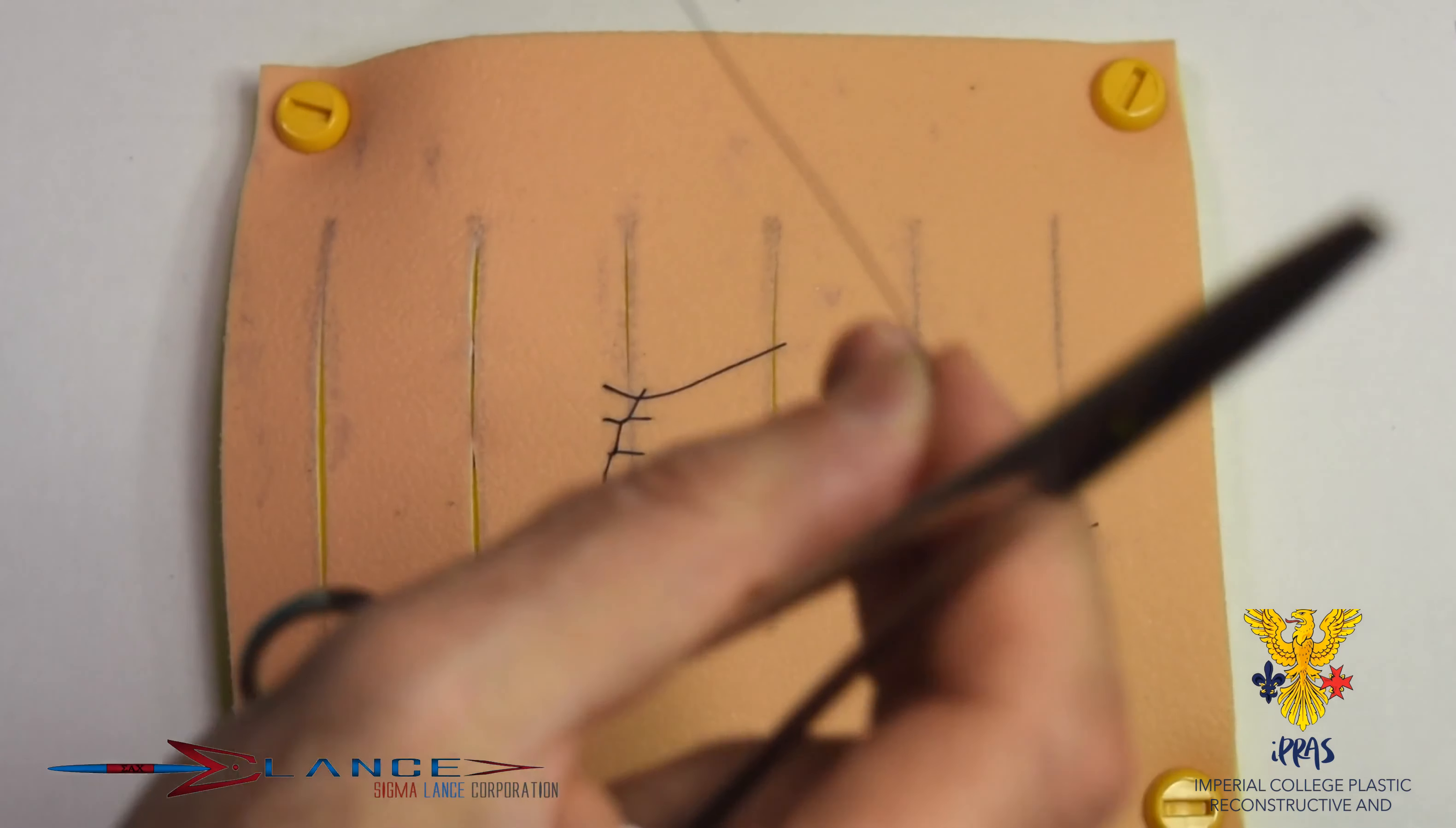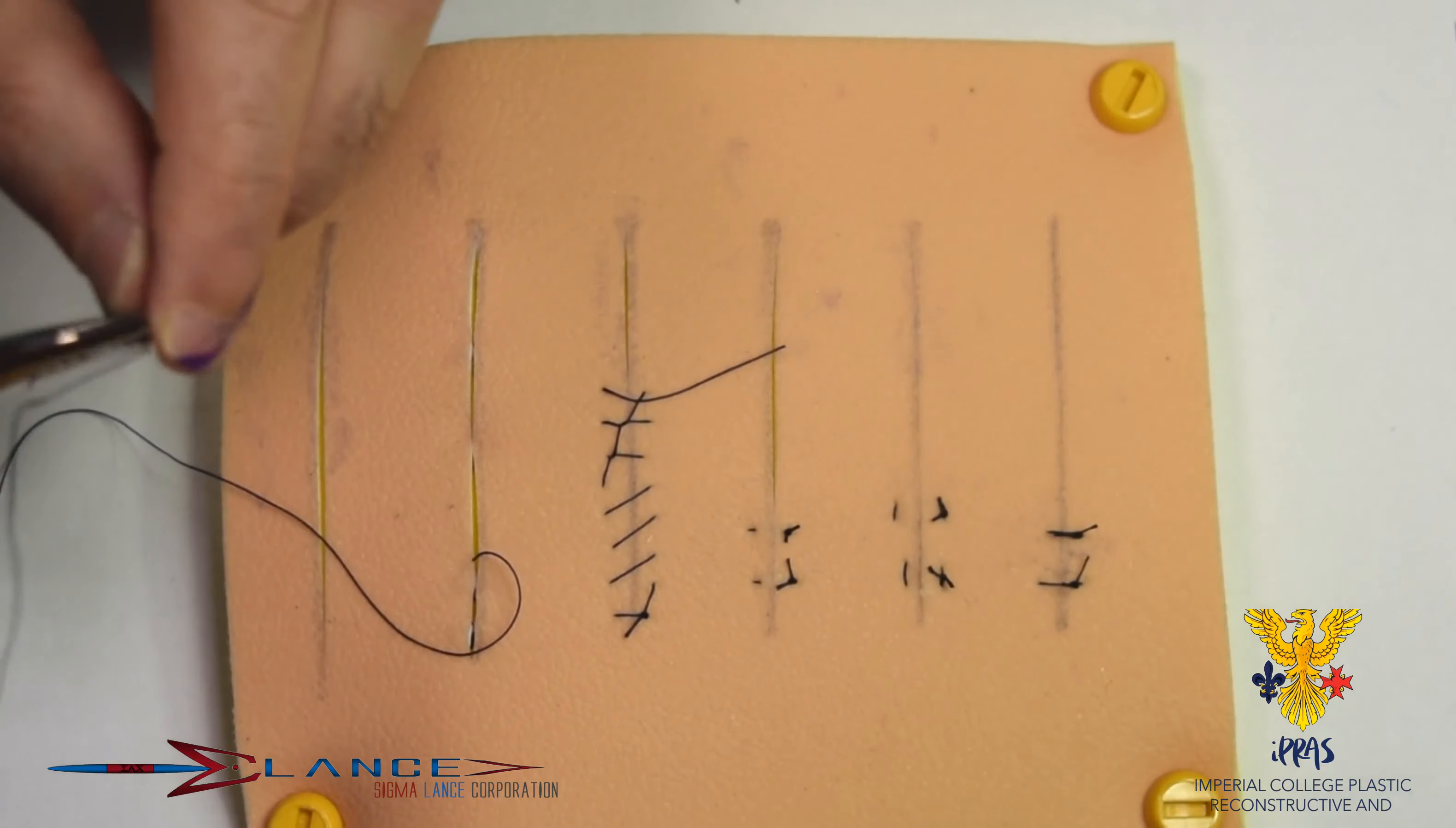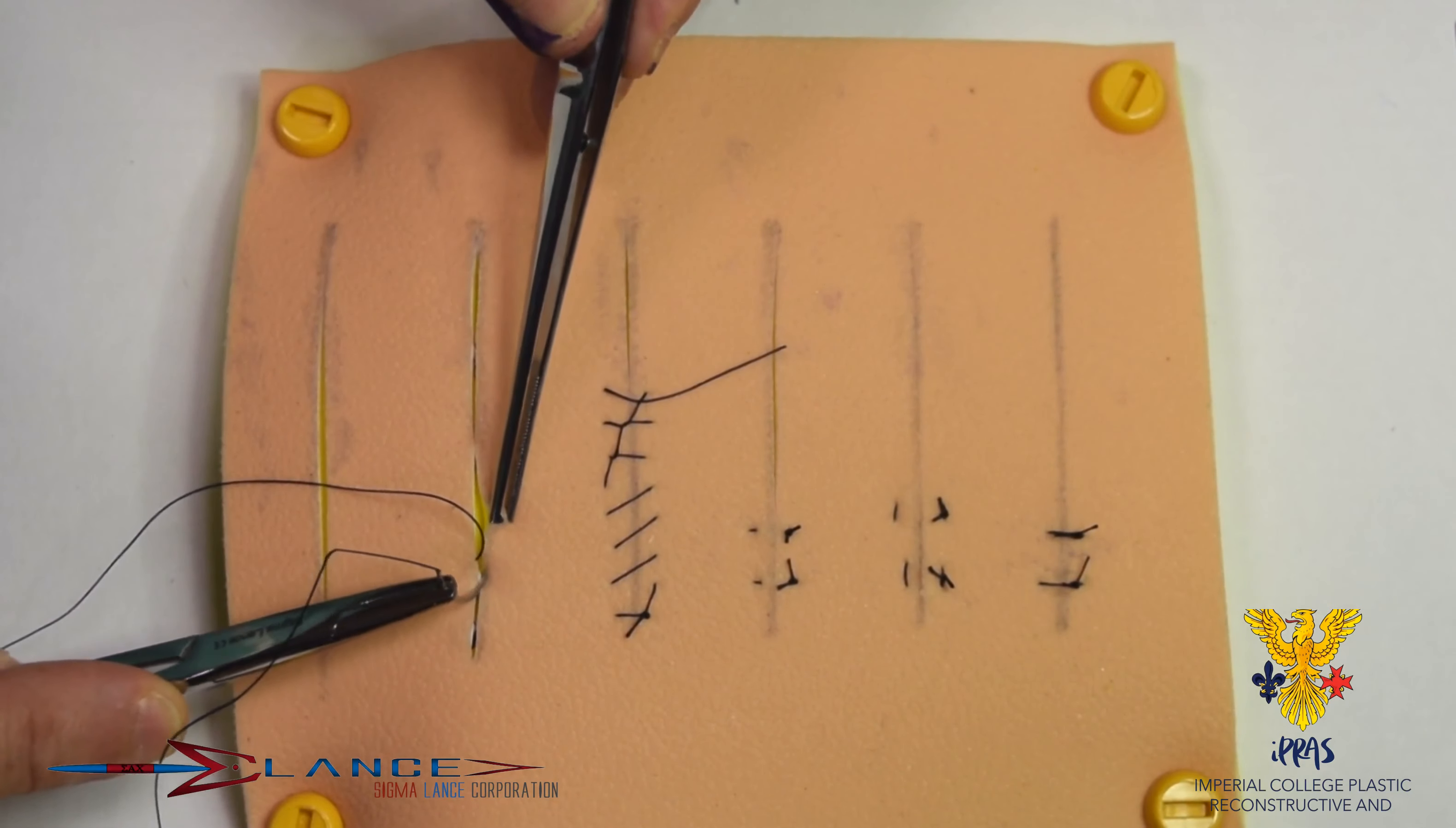And here now, to get this wound closed, I don't want to be ahead of that point, I need to be a bit behind at that point. And so the bite doesn't begin there. The bite begins behind the last suture.